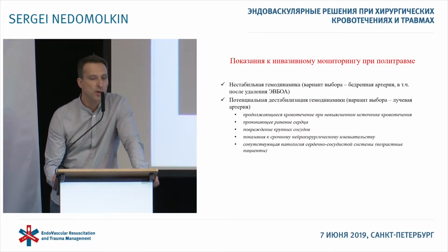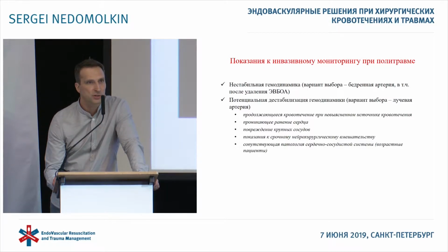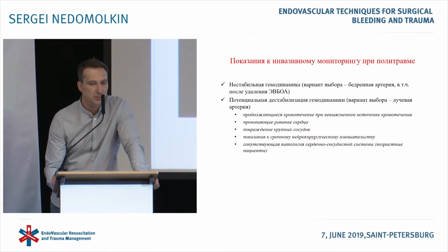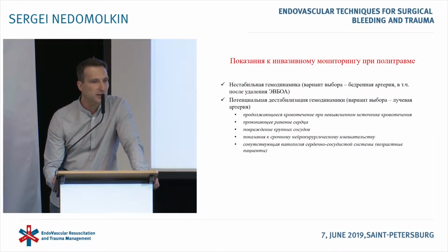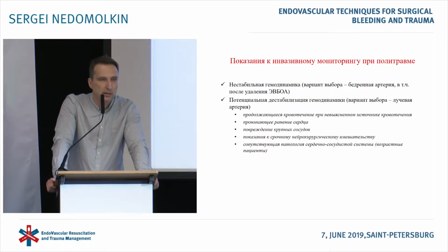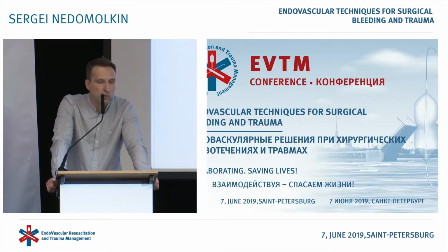And to conclude, I want to mention the indications for invasive monitoring. This invasive monitoring is indicated for patients with unstable hemodynamics. Catheterization location of choice is the femoral artery. Also, the approach that was done for the femoral occluder.